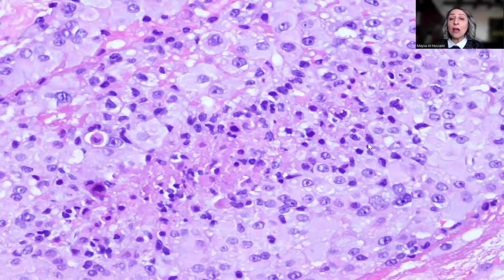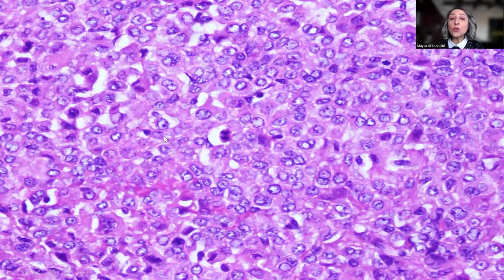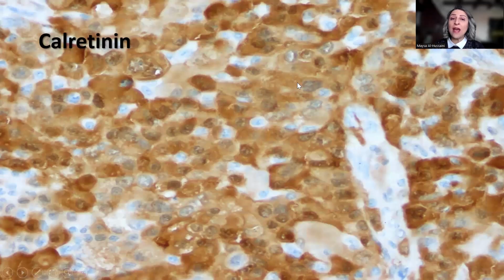There is an area of necrosis as well, and some myxoid degeneration with some hobnailing, which would again bring into the differential diagnosis serous carcinoma, in particular, whether of the ovary or a primary peritoneal, and more solid sheets of the tumor cells. Definitely carcinoma is probably still at the top of the differential diagnosis, but we have to think of mesothelioma at this stage.